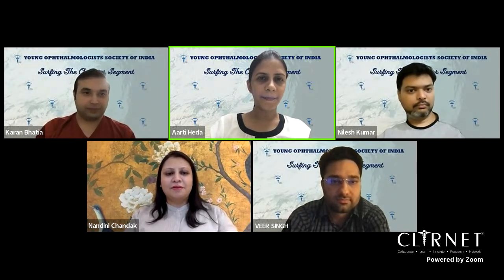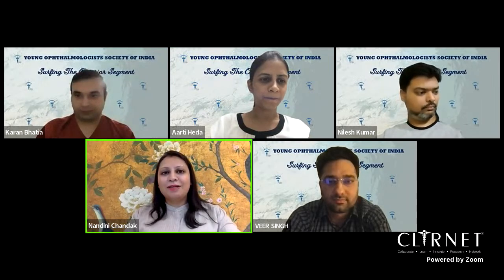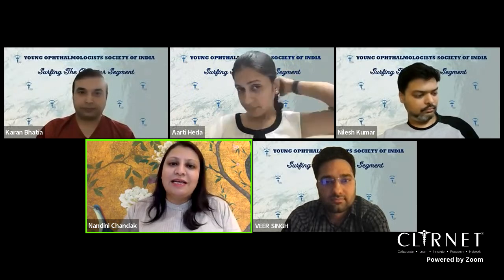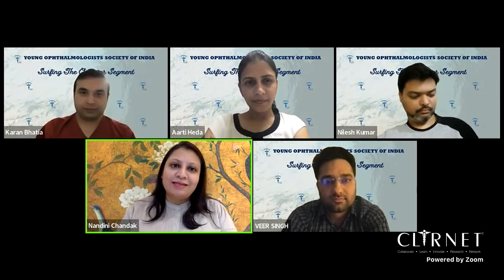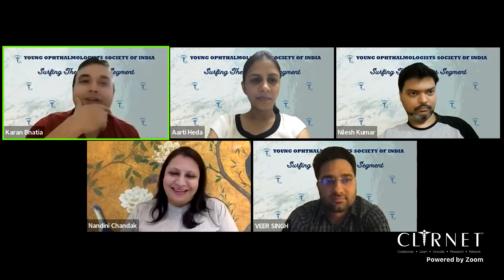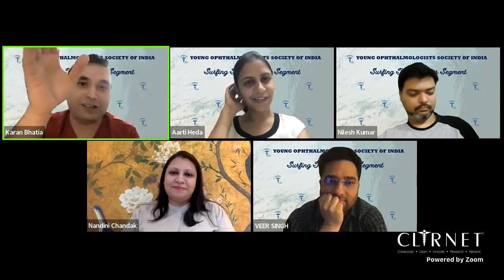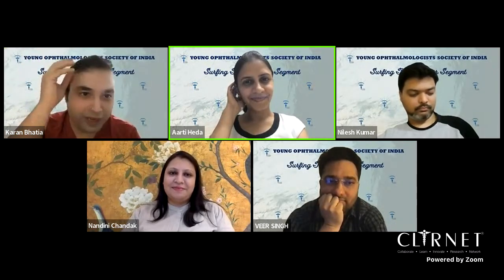Dr. Nandini? No, I think just to complete that question, Karan, can you answer what would be the calculation for the ACIOL? Though none of us are actually doing ACIOL nowadays, I think the question was how would you... Actually, I have forgotten. Was it minus 3 as far as I remember? Yes. I haven't done it since my residency days, and that is one thing I say: leave the patient aphakic, but don't put an ACIOL. Because as a cornea surgeon, I have seen so many endothelial decompensations post ACIOL.